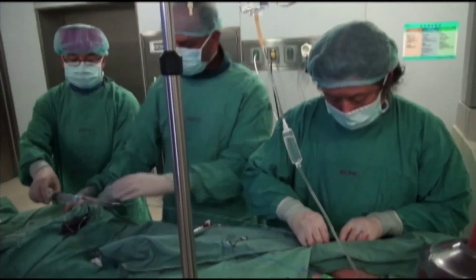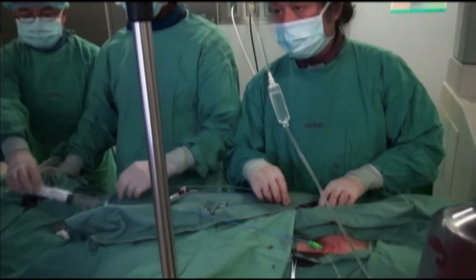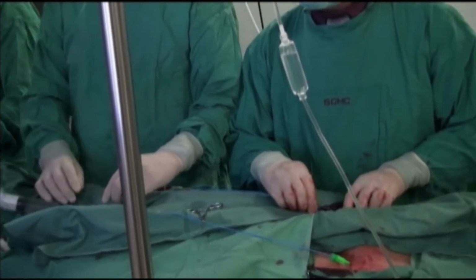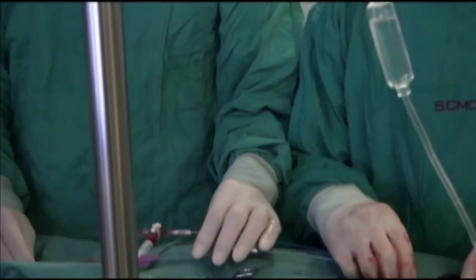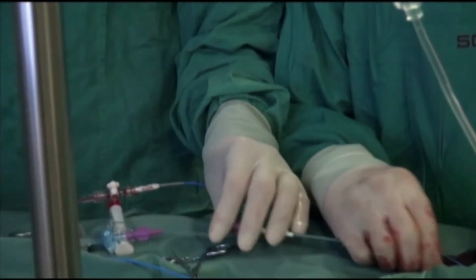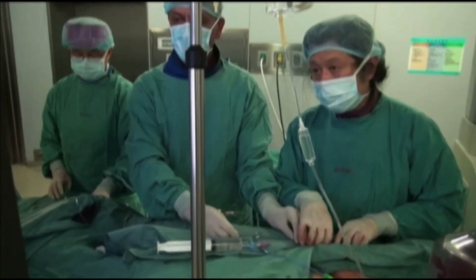He's introducing a sizing balloon in the groin. We have a 035 super stiff wire in the left pulmonary artery. We are going to do balloon sizing. At the same time, we will do a coronary angiogram, or in this case, we'll do actually an ascending aorta angiogram to look at the coronary artery proximity to the RV outflow tract.